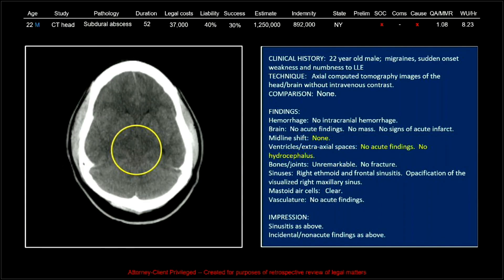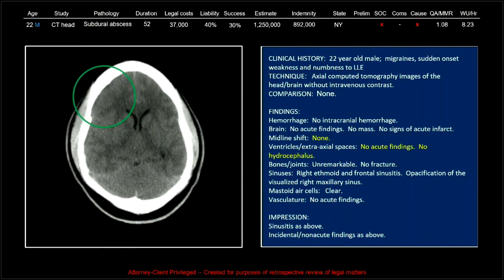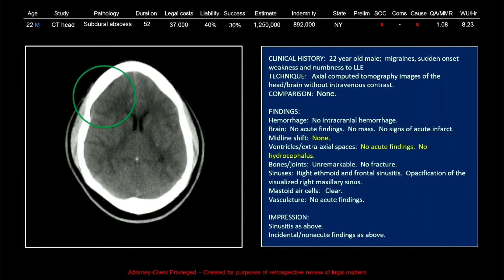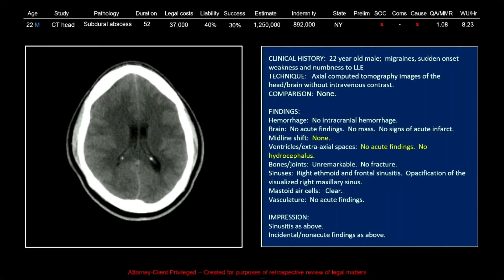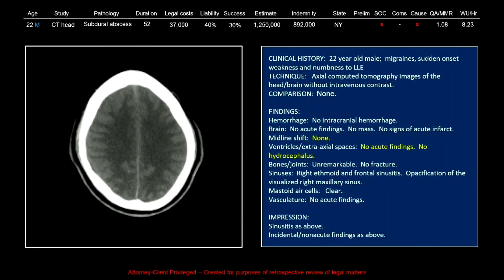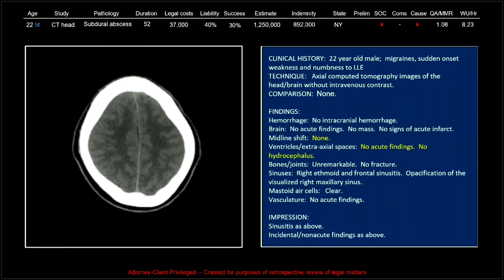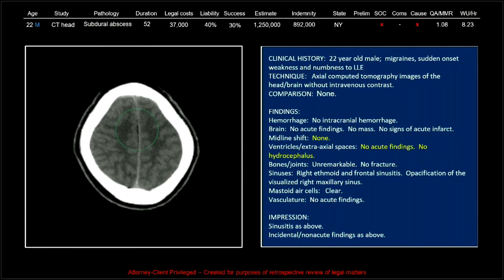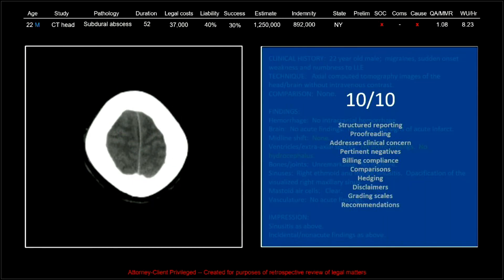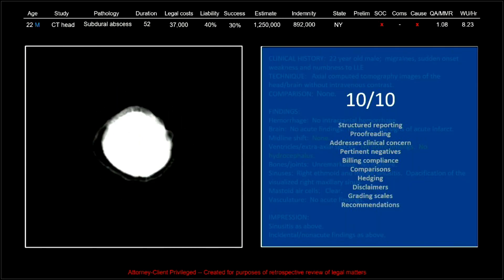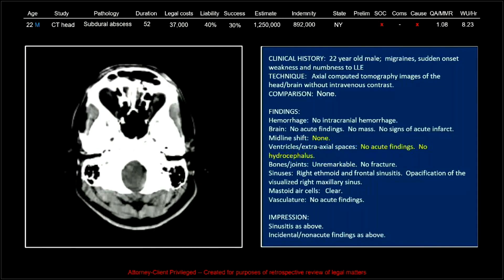Look at that brainstem. So this is definitely something that could have been called, and as you can see, no acute findings was the reading here, and it got a 10 out of 10 for being a good report.